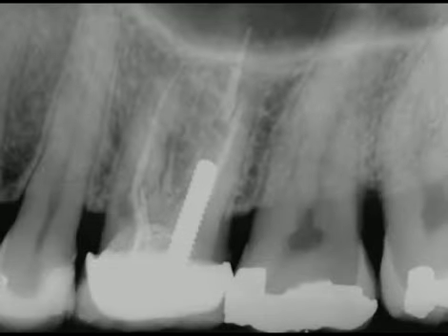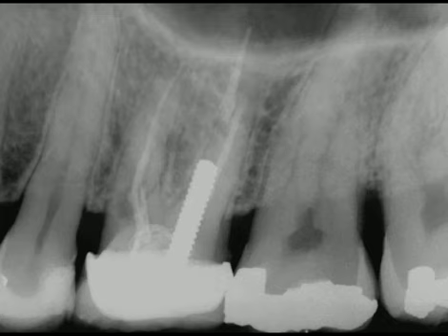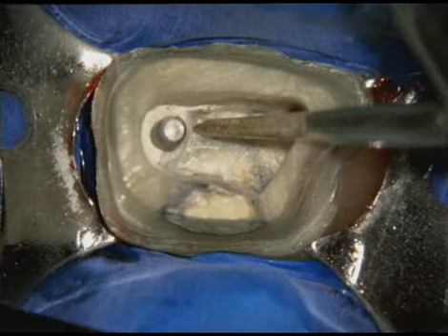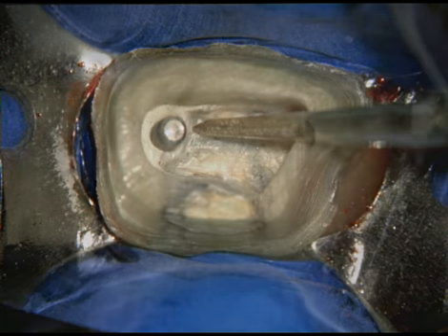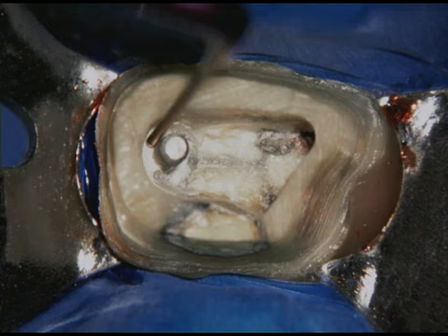This radiograph shows incomplete endodontics and resultant failure. Note the poor fitting crown, internal resorption, furcal involvement, and the large post. Circumferential material can be progressively sanded away utilizing appropriately sized Pro Ultra Endo tips. A smaller, more parallel instrument may be selected when space is restricted.